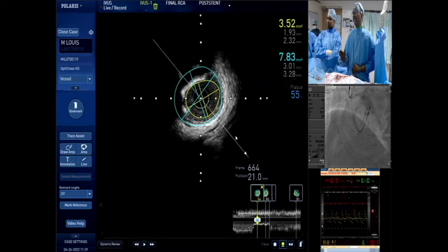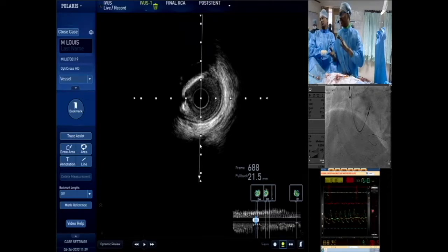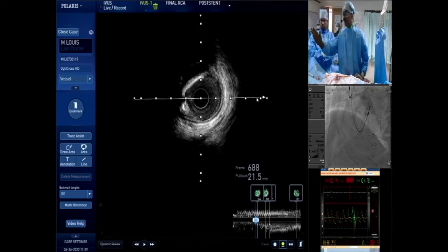So I think this is the area which we are concerned about. You can clearly see here the size of the vessel before our marker, and the size of the vessel after B3. So there is a clear negative remodeling in the vessel. See, the moment your B3 also becomes like the proximal vessel, your plaque area will go down. So we don't want to do anything here. Bookmark. And uniformly the areas are more than 3.6 mm square. Bookmark here and show me the B1 area.